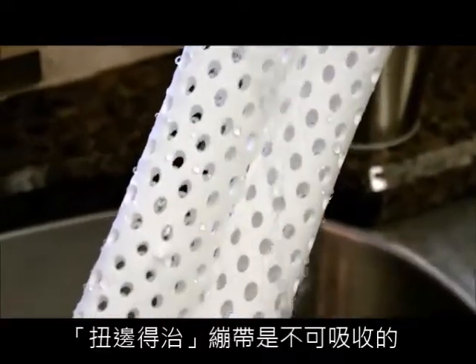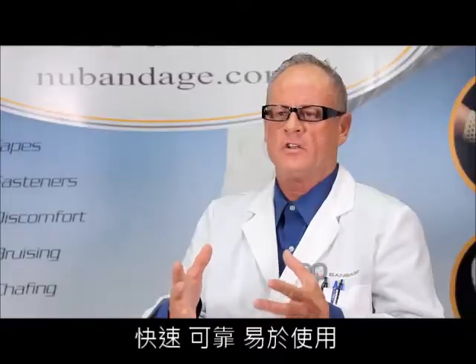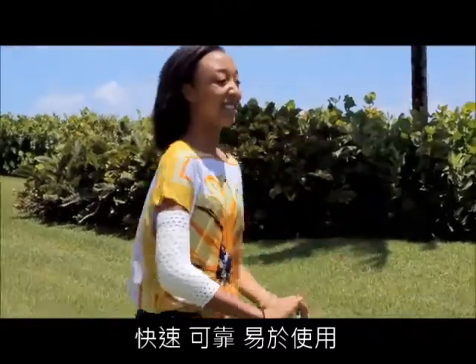New Bandage is non-absorbent. It's hand washable, it's sanitizable, it's fast, reliable, and easy to apply.